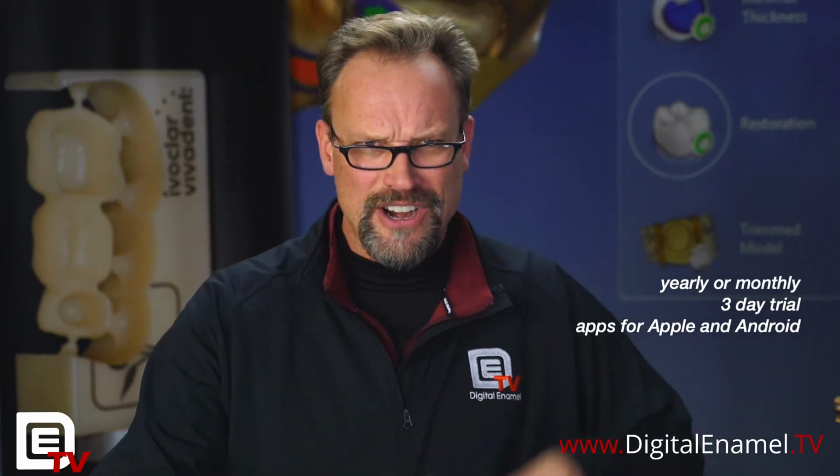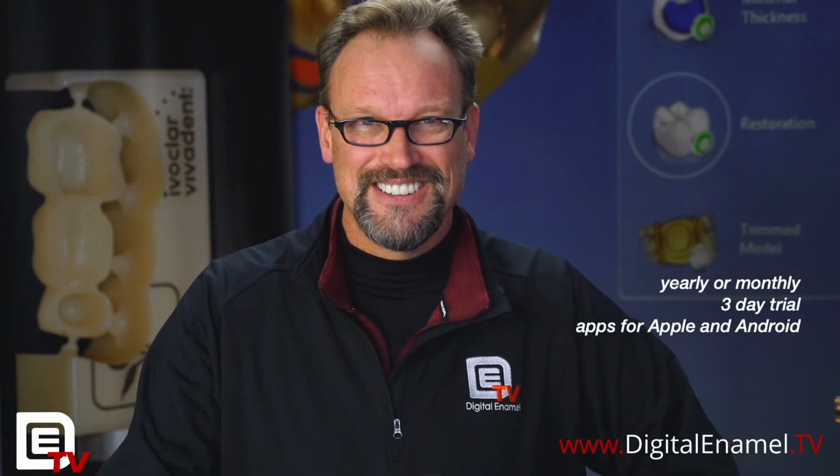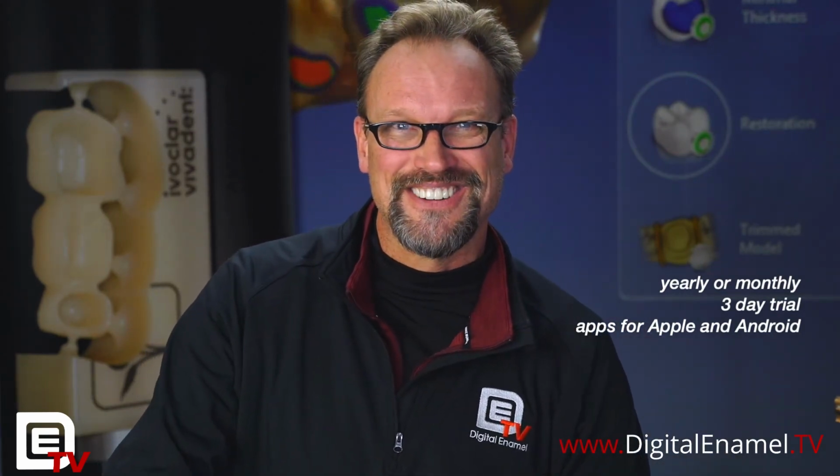Digitalenamel.tv. And never, ever, never edit that model.